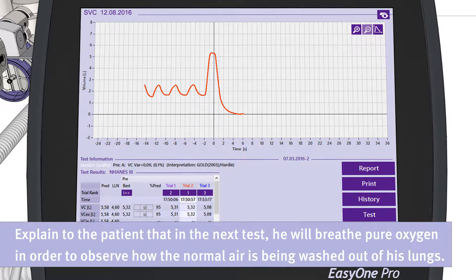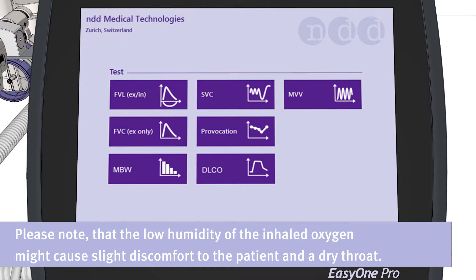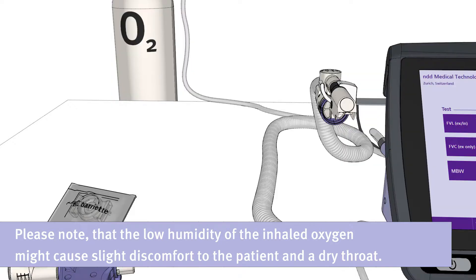In preparation for the next test, please explain to the patient that he will breathe pure oxygen in order to observe how the normal air is being washed out of his lungs. You can now start the MBW test by clicking on the test button. Please inform the patient that the low humidity of the inhaled oxygen might cause slight discomfort and his throat might be feeling dry.